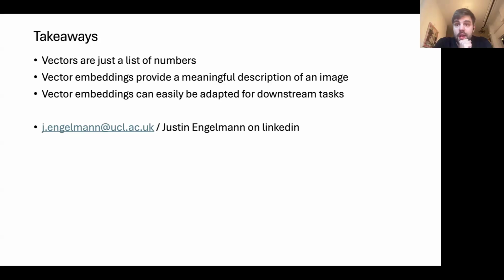Yes, so those are excellent questions. The first question touches on quite a lot of different things, namely the question of interpretability, and related to that, something that people have looked at a lot under the umbrella of latent space disentanglement. Vector embeddings are in what's called a latent space. A latent space just means that none of the dimensions mean anything physical.